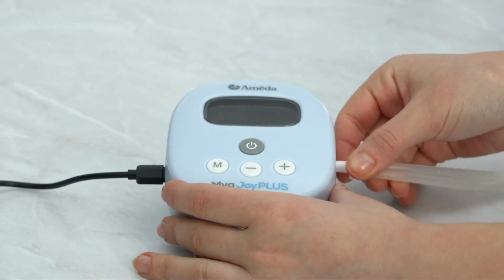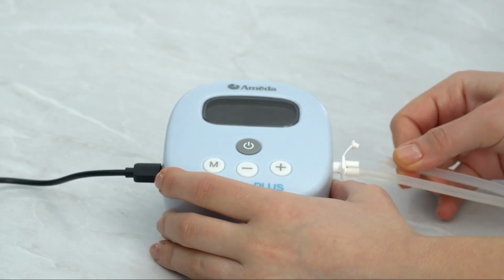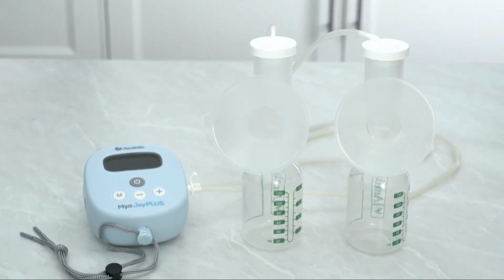Insert the tubing adapter into the right side of the pump. For double pumping, both tubes should be attached. For single pumping, remove one tube from the tubing adapter and close one side. Now you are ready to use your breast pump.